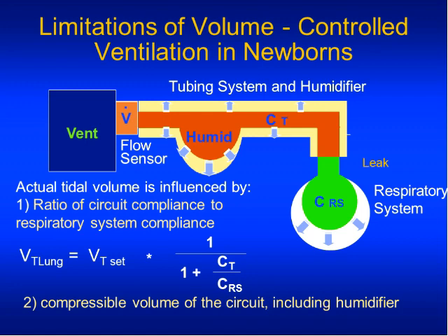So back here at the ventilator is where the tidal volume is measured and generated. And in a large patient whose lungs are much larger than the circuit, it's not a big problem. There's a little bit of loss of volume into compression in the circuit, but that's easily compensated. But when the lungs are tiny in a small preterm infant and they're smaller than the volume of the circuit and humidifier, then that loss becomes much more dramatic. So without going through the math here, you can appreciate that the smaller the baby relative to the circuit, the stiffer the lungs, the more volume is lost to compression.